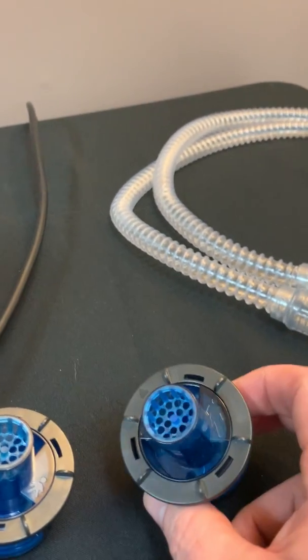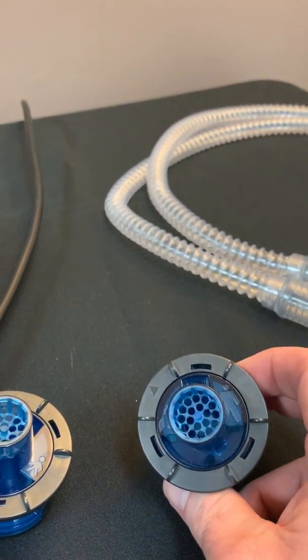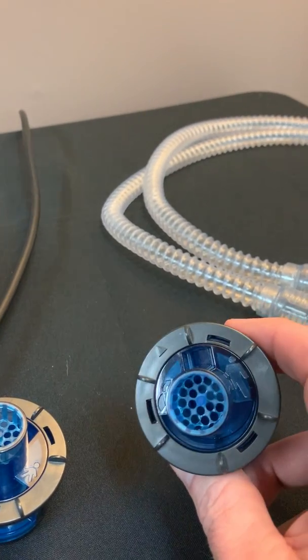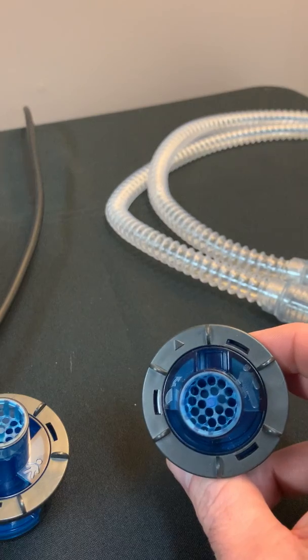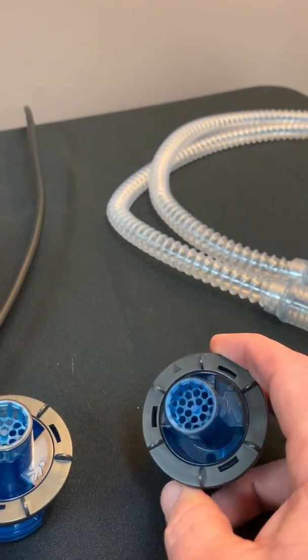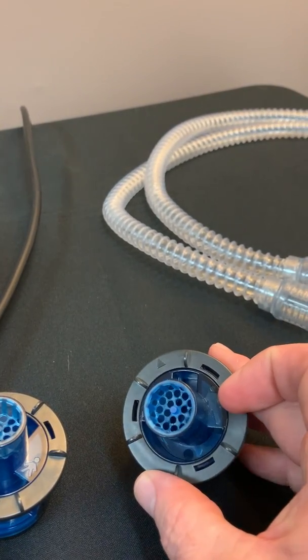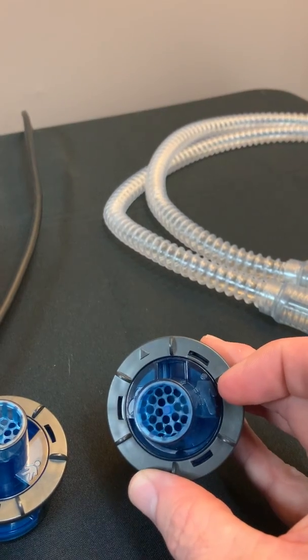But the other thing that you're going to need when you use a dual limb circuit on the Vivo 65 is you're going to need the exhalation valves and these are our two exhalation valve inserts. This is the adult insert and as you can see here on the side of the valve there is a large person.